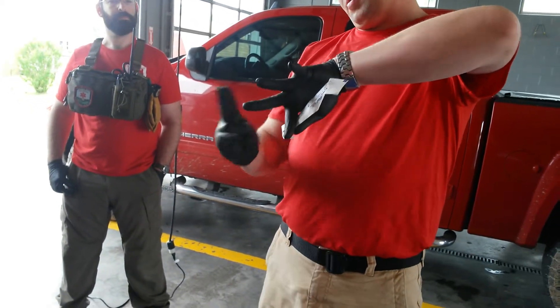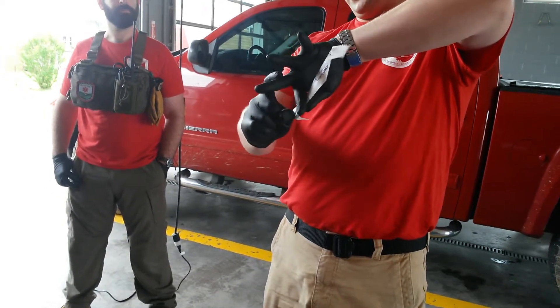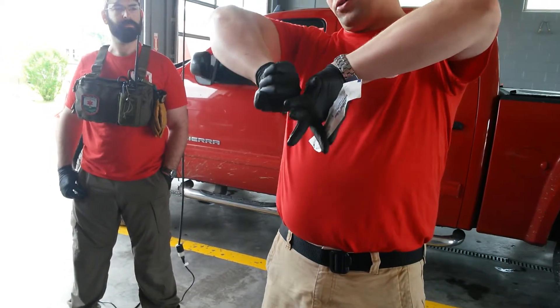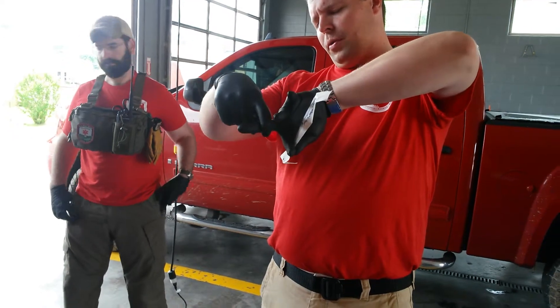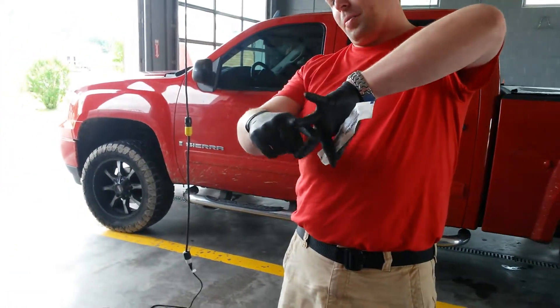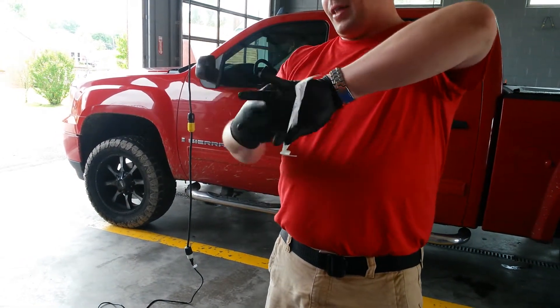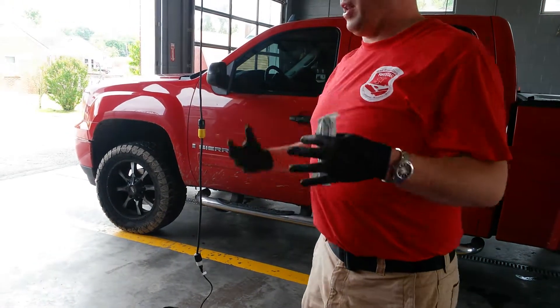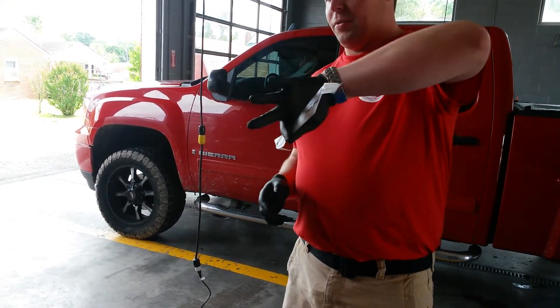Then you would come out with your clamps, take your finger, and go in. The idea is to feel inside the chest cavity and sweep entirely around to make sure there's no adhesions. You should feel parietal pleura on this side, visceral pleura on the back of your finger, which is the lung tissue itself. Once you've done that, you've ensured that you've let any air out of the chest wall and any air out of the pleural space, and that he's been successfully decompressed.